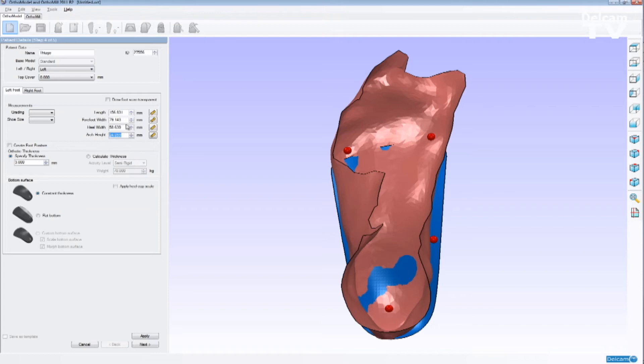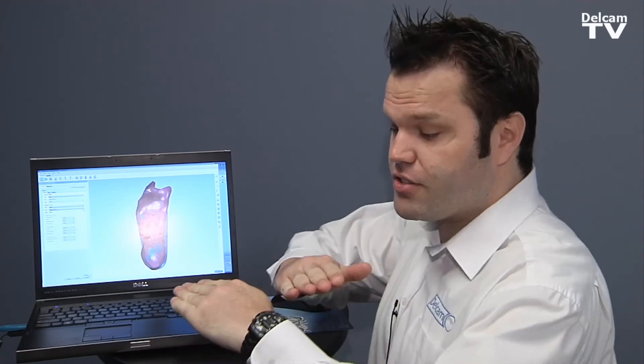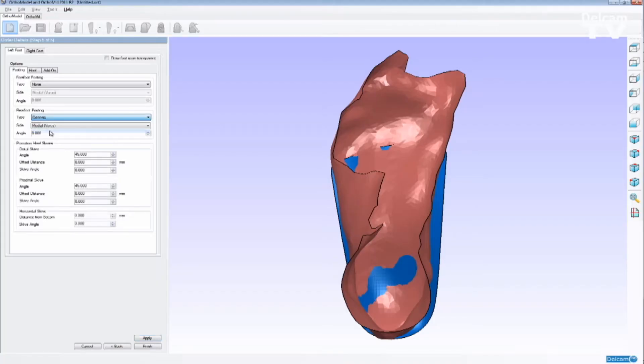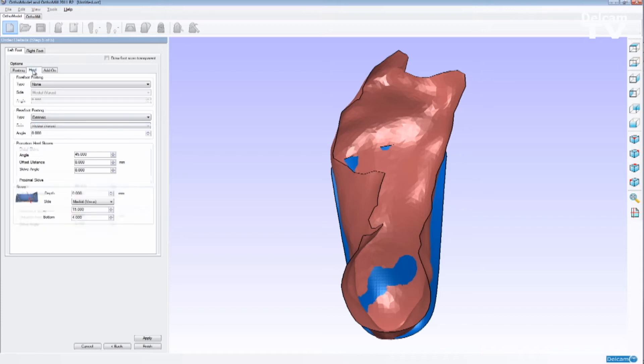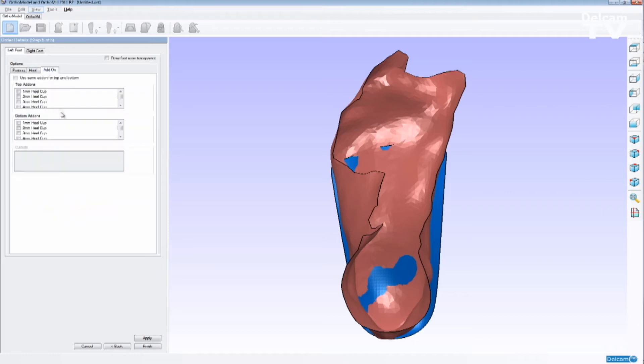I'm able to add modifications, such as controlling the forefoot width versus the rearfoot independently, so we can apply varus and valgus. I'm going to select a rearfoot posting as extrinsic. We can change the heel posting as well, such as adding a heel wedge or a heel lift for leg length compensation and for high heel shoes. We have a heel pitch and heel cup heights as well that we can control.